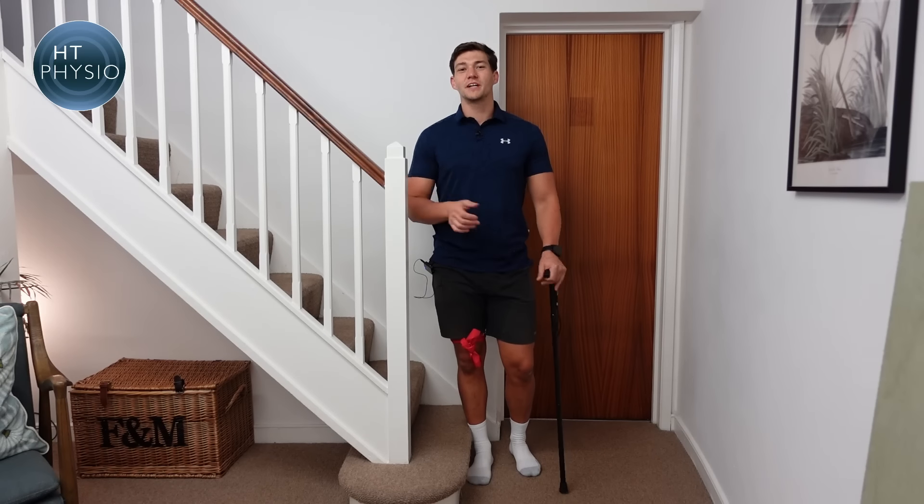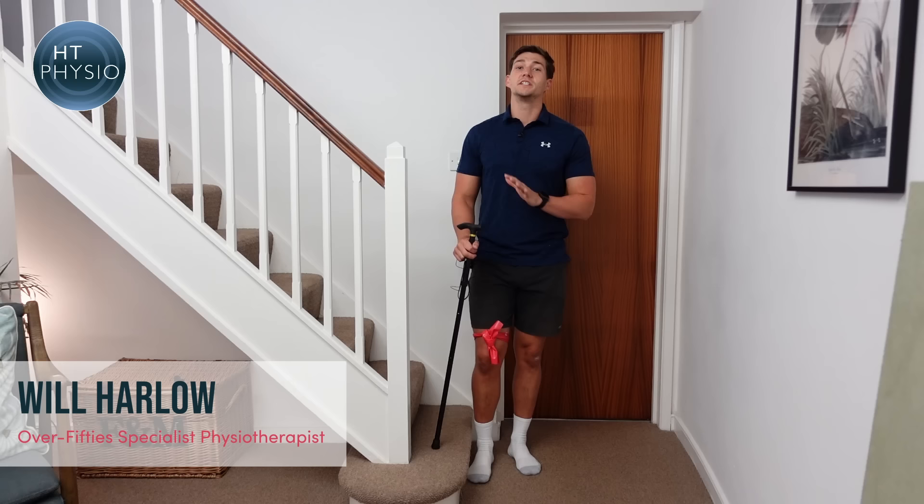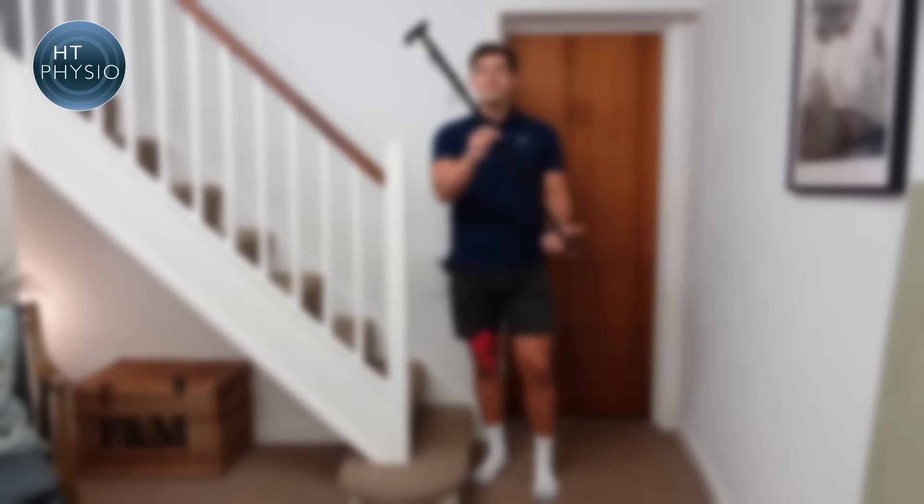Hello everybody, welcome back to another episode of the HT Physio Quick Tips series. My name is Will Harlow and I'm the over-50s specialist physio here at HT Physio in Farnham. In today's video I'm going to be showing you how to use a walking stick or cane on the stairs, because many of my audience use a walking stick and are happy with it on flat, but aren't sure how to use it properly on stairs.